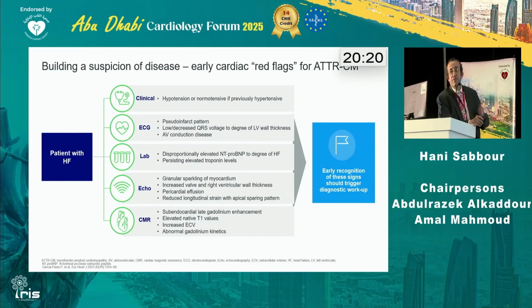If you ask for a cardiac MRI, you have to tell your MRI radiologist, I'm looking for cardiac amyloid, because it's a special protocol and a special series that you won't get on a standard MRI. And I have several patients where the MRI was not specifically requested like this, and the answer came back sarcoidosis or myocarditis, right? So you need to inform the MRI physician that I'm specifically looking for amyloid so they can set up the protocol for that. And I'll ask Dr. Ahmad a question about this.